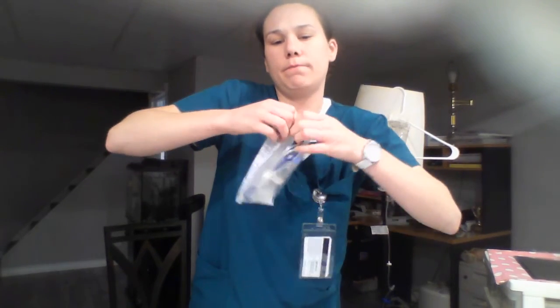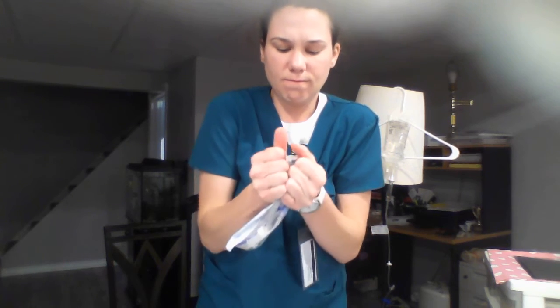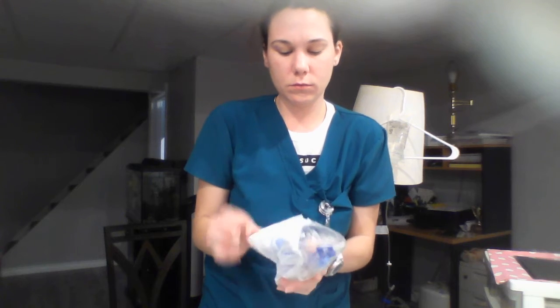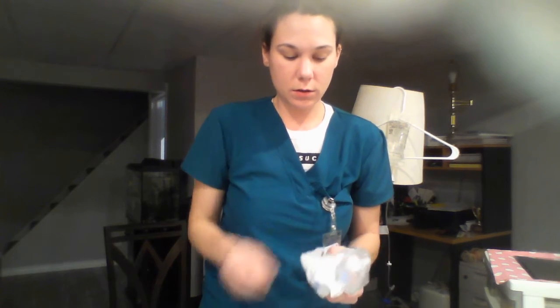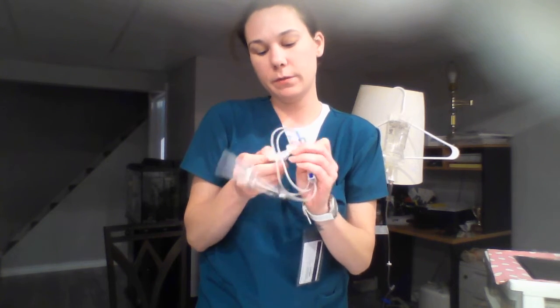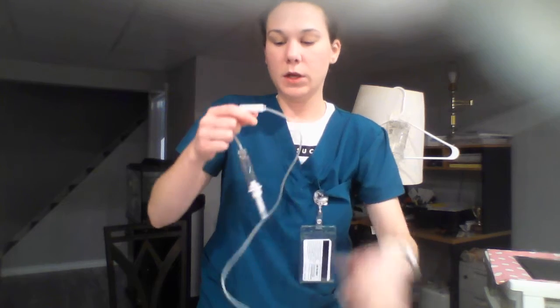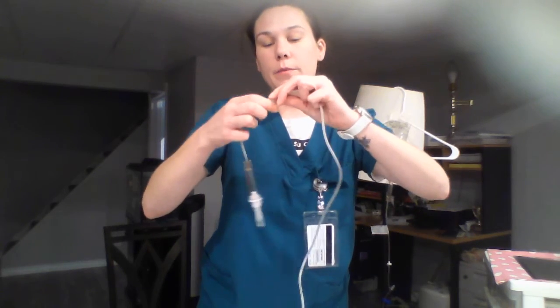So opening this. Hook, secondary line. I'm going to remove the tape here. I'm going to close the roller clamp right away.